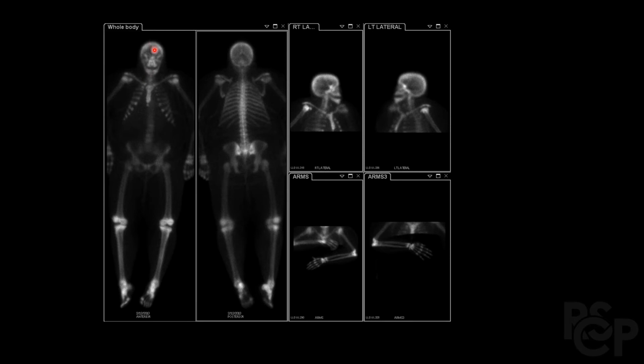Again, start from the top and work our way to the bottom, and we notice how there's increased uptake present throughout the skull. This is very diffuse uptake, which is prominently visible. Working our way downwards, we see increased uptake in the sternum and the shoulders. And again, this is very symmetrical compared to what we previously saw. Similarly in the ribs over here. Then we see the increased uptake in the pelvic area, and further down in the knees, as well as the legs, and also in the wrists and the elbows.